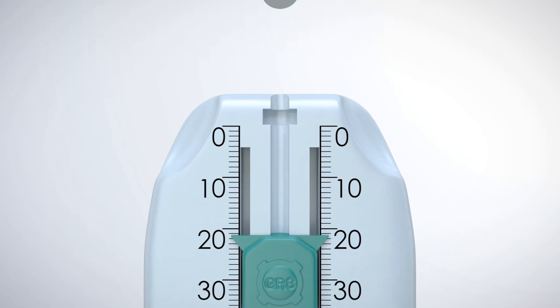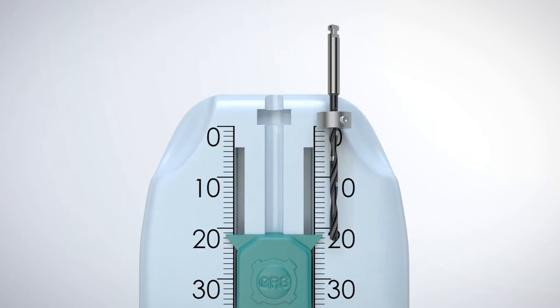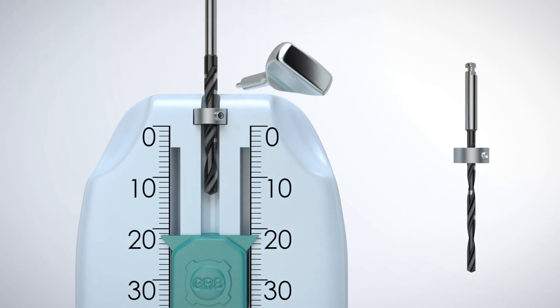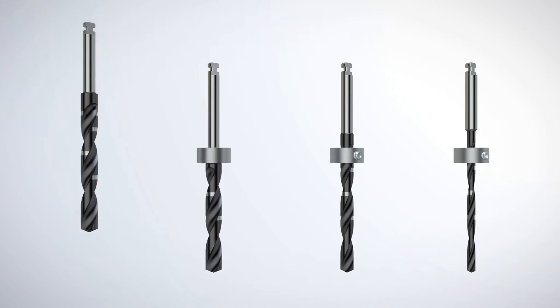The GRS depth gauge precisely positions an adjustable GRS drill stop on a surgical drill, ensuring consistently accurate osteotomy depth. Simply place a GRS drill stop into the slot, slide a drill through the drill stop, and tighten the set screw using a GRS drill stop driver. The GRS depth gauge ensures all drill stops of any drill sequence are set to the same precise measurement. The GRS Surgical System also supports fixed drill stops and may be used without drill stops.